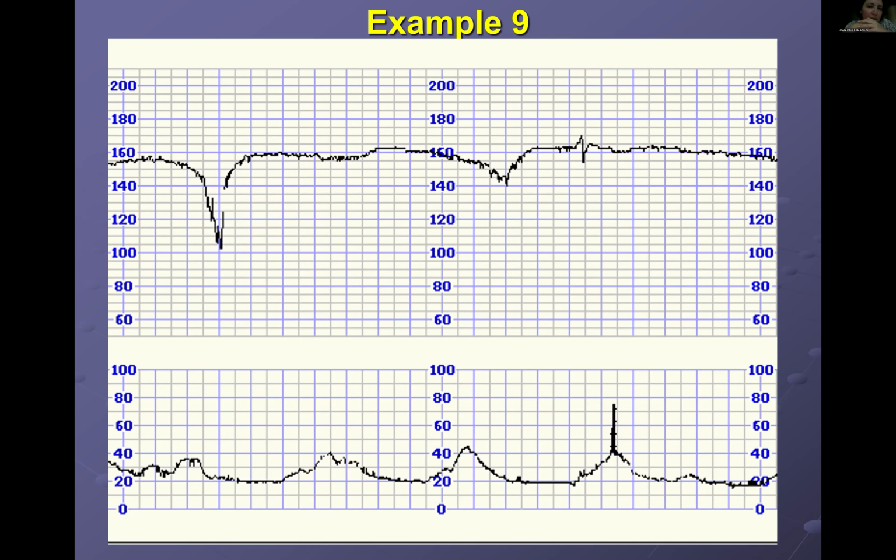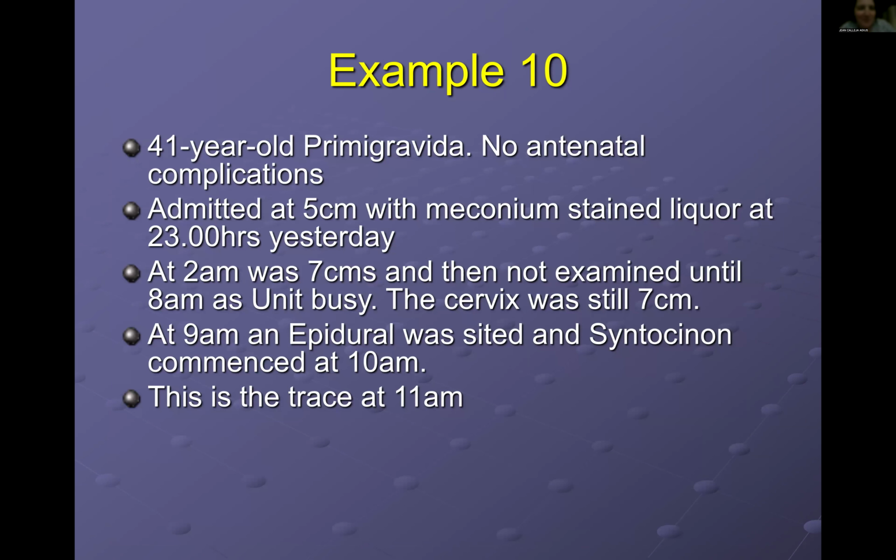And especially if the CTG improves, I would probably consider giving dexamethasone to the mother, because in case you need to expedite delivery and the baby is born prematurely, you improve the prognosis a bit when the baby goes to NPICU. So this would be a good situation. Very good, you've managed her very, very well. She's very lucky to have come to your unit.